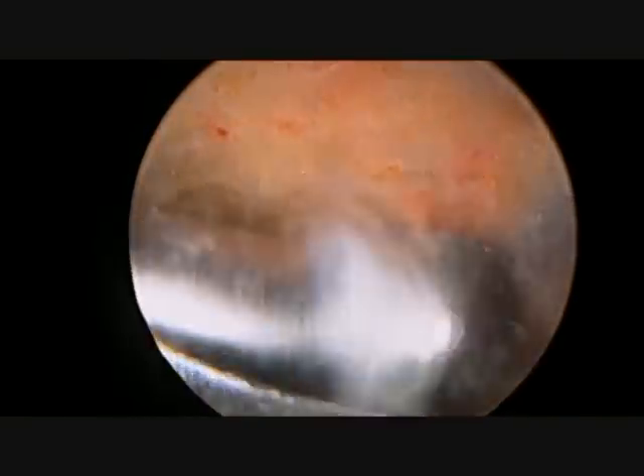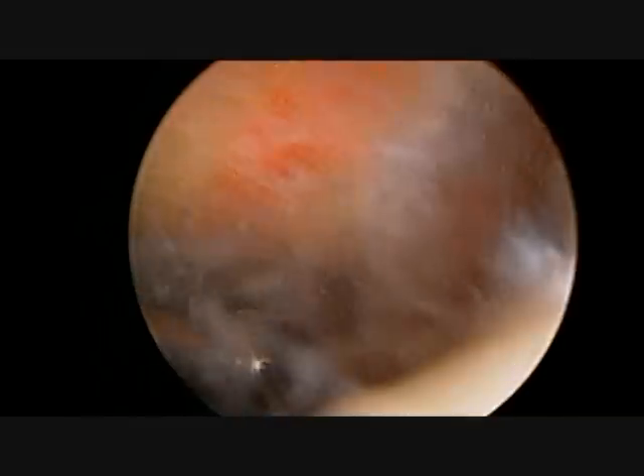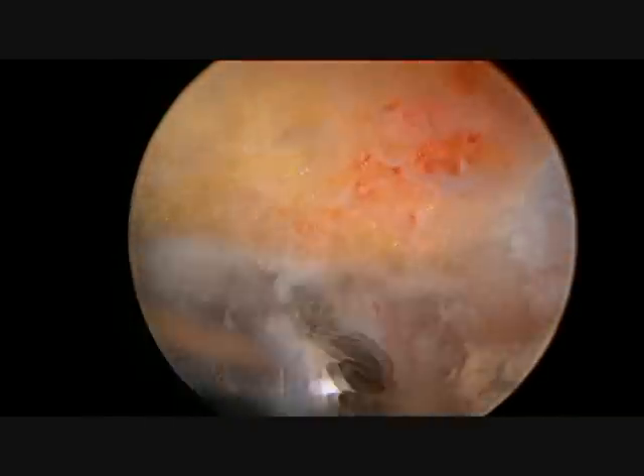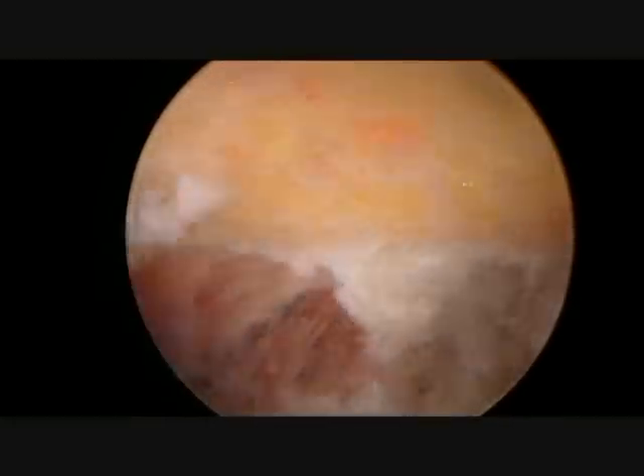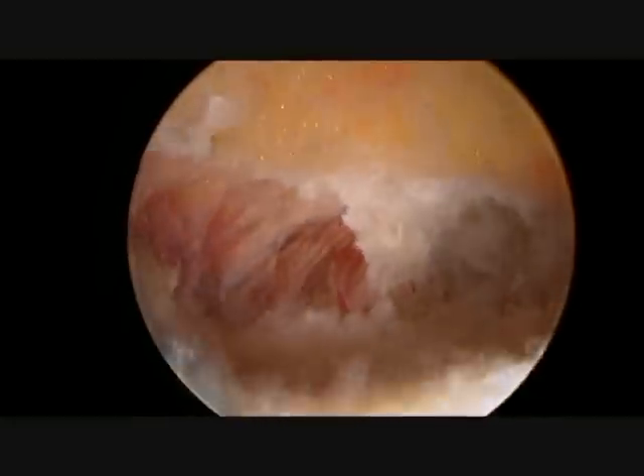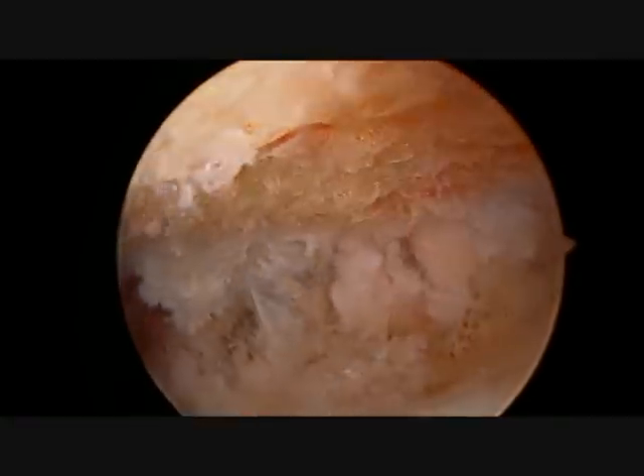The rotator cuff was examined at the start of the operation and showed no evidence of a tear. The subacromial space will be thoroughly washed out, any bleeding will be stopped and stitches will be placed in the wound. The patient will then be placed in a sling and can begin moving their shoulder without limitations as soon as pain will allow.